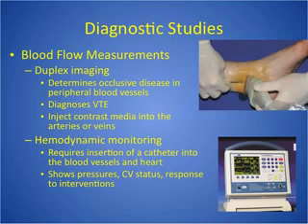So sometimes it's the wrist for just blood pressure monitoring, but it does require insertion of a catheter, and that catheter takes various pressures, capillary wedge pressure and pulmonary artery pressure, all these different pressures, and really monitors cardiovascular status immediately.